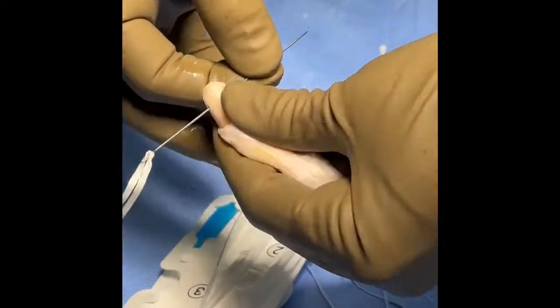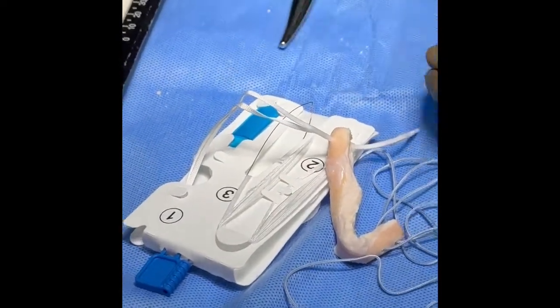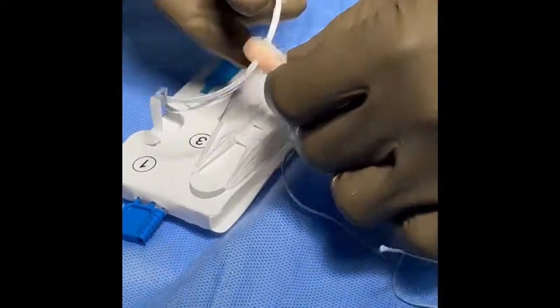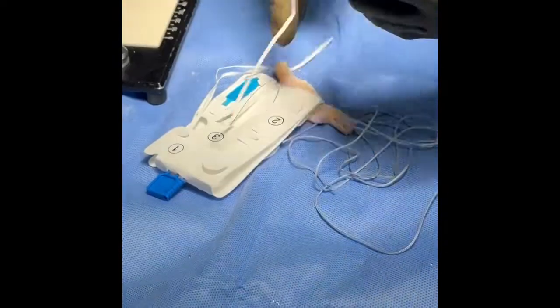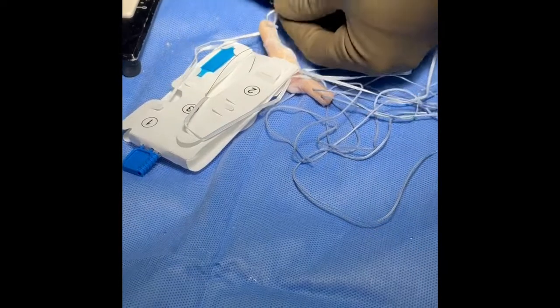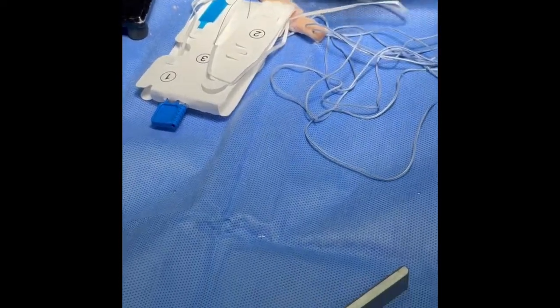Subsequently, suture is passed through the femoral bone plug that is connected to an adjustable loop system. Consider using tape to prevent easy cutout of the suture through the femoral bone plug. Some of the advantages of an adjustable loop system include circumferential bone healing in the tunnel and the ability to dial in how much of the bone plug is pulled up.